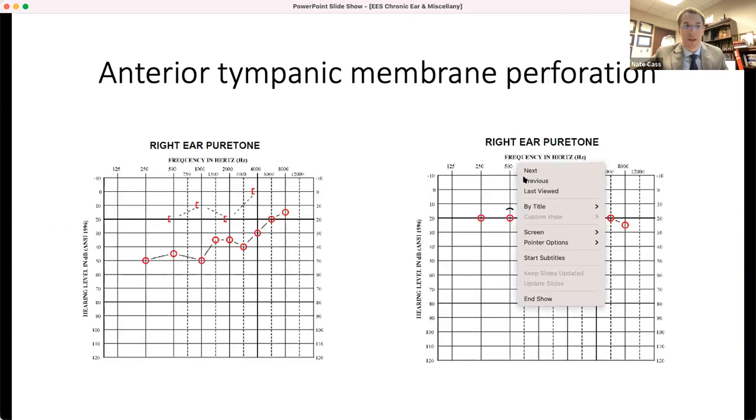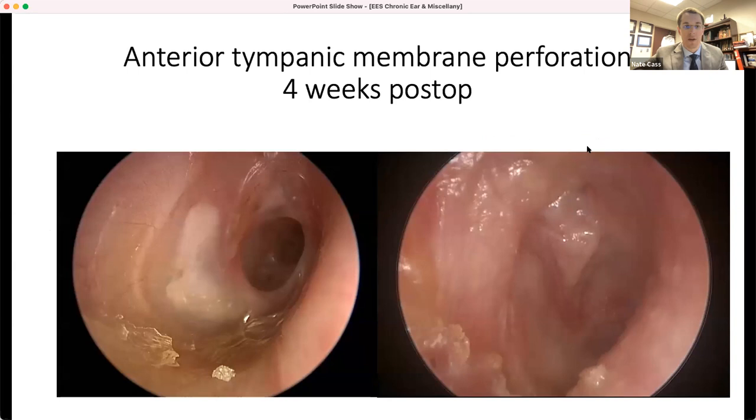I've done it and seen it done primarily when the flap is so unwieldy for the ear canal, kind of like you were talking about, where you kind of have a more direct route. The one thing I'll say is that, two things. One, I think it's hard to take the drum off the malleus when you don't come from the very top. But I have a lot to learn in that regard, I know. So I'll let you know in a year or two what I think of that from taking off from the bottom up. But I see what you mean.